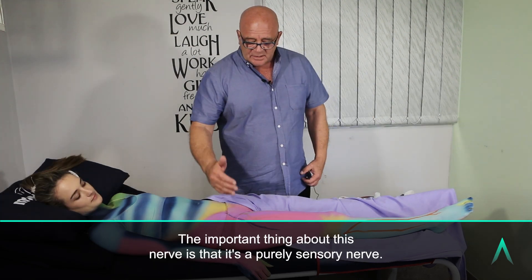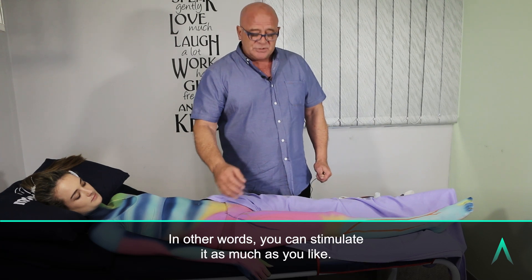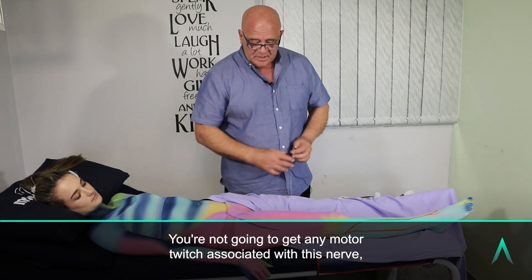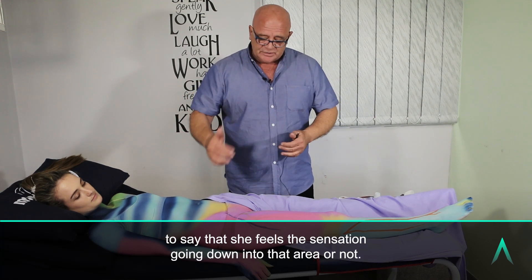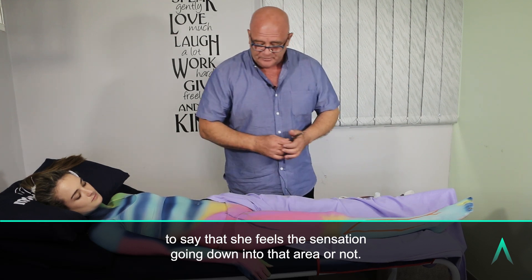The important thing about this nerve is that it's a purely sensory nerve. In other words, you can stimulate it as much as you like and you're not going to get any motor twitch associated with this nerve, but you're going to rely on the patient giving you feedback to say that she feels the sensation going down into that area or not.